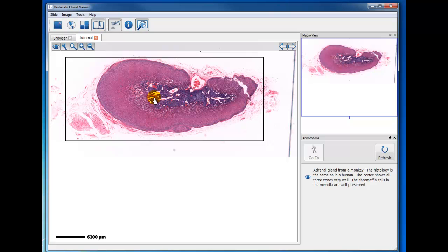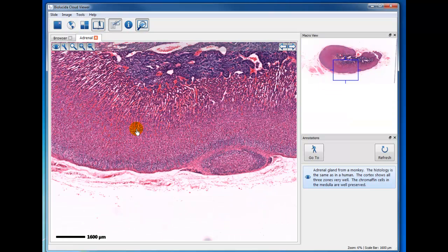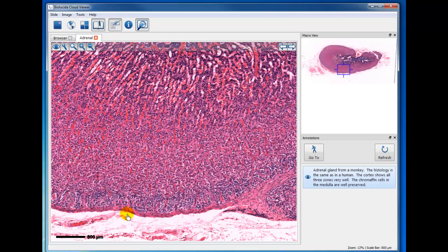From this vantage point, the rather basophilic center, that's the medulla. And there are a lot of large blood vessels there because they carry the products out, the hormones: the mineralocorticoids, the glucocorticoids, and some other hormones secreted supposedly by the zona reticularis, some androgens. And so we just have this one annotation, but I'm just going to enlarge this so that you can immediately see, I think you can see that there are three patterns here.